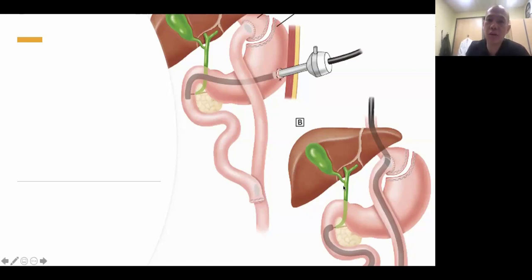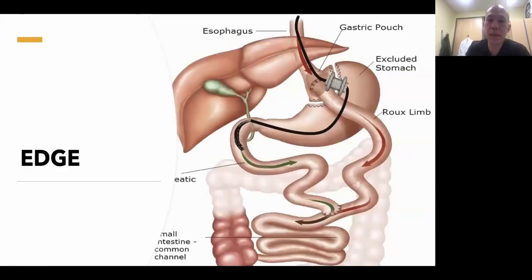And what we've adopted more recently also is the laparoscopic assisted approach, but that requires general anesthesia, requires two operators, the surgeon and the endoscopist, and can be very difficult to coordinate. The new way of doing this, and we've done about 10 cases, and we can speak to the bariatric group about this. Most of the cases came from elsewhere.